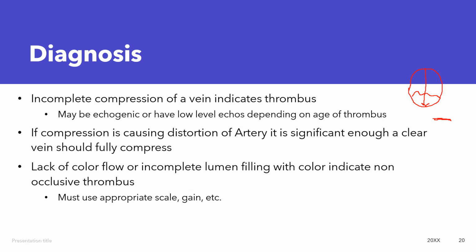And one thing you don't want to do a lot of, but if you do suspect that there is clot or you're not sure, you could augment and see if that would move the blood flow enough that you could determine whether it was clot or not. I know we just said we're not augmenting in thrombus, but that would be if you're just not able to make the diagnosis, sometimes that can be helpful.